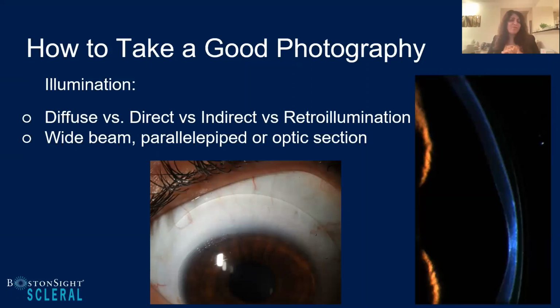I was going to say that all of us have been through a period where we were learning slit lamp 101 and really holding your light source at 45 degrees and moving it and changing the different heights and beams. And now it becomes part of your muscle memory that you don't think about it. But I think you hit the nail on the head, that really manipulating your light, your magnification and your beam heights can really influence quite a bit of what you're evaluating.